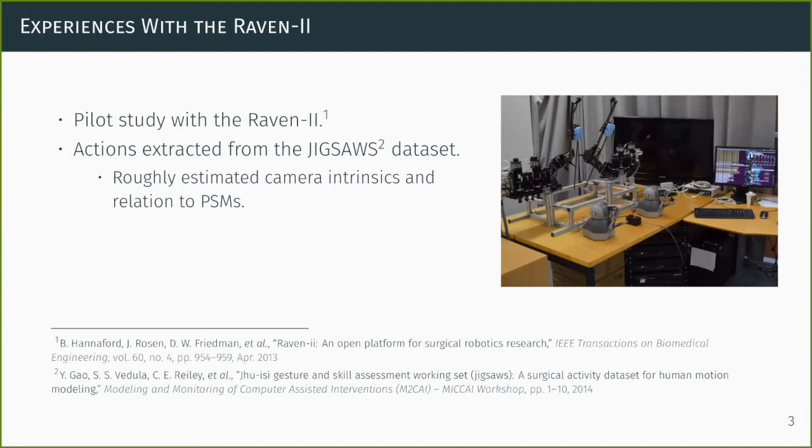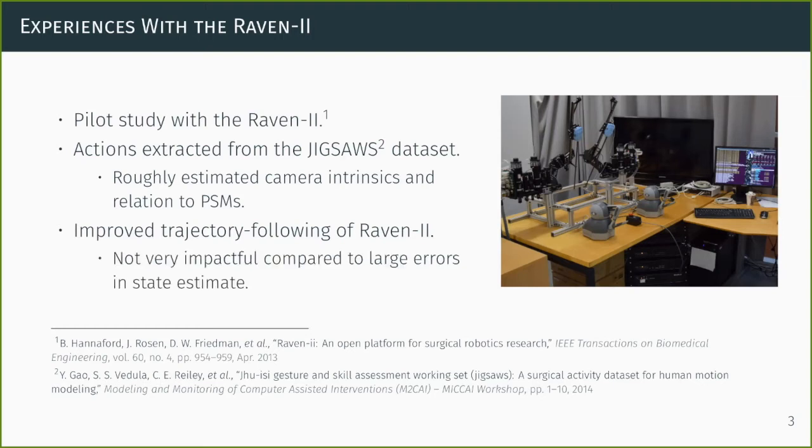I noticed during this work that beside the relatively poor state estimate of the Raven, it was also exhibiting pretty poor trajectory following performance, and we did some work to improve that. But still, the work was not very impactful considering the state estimate errors themselves. So all in all, I guess you could say my attempts to automate surgical tasks using the Raven was not very successful.